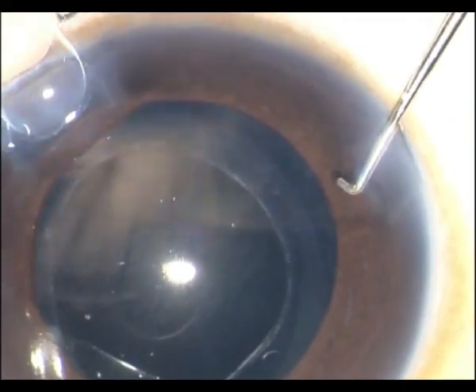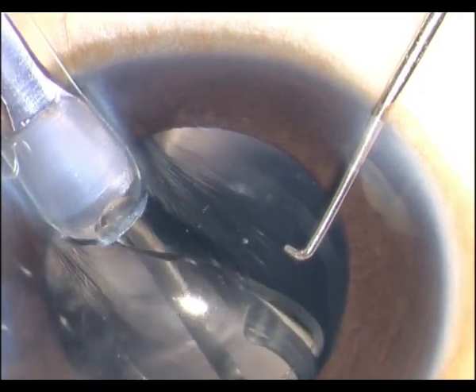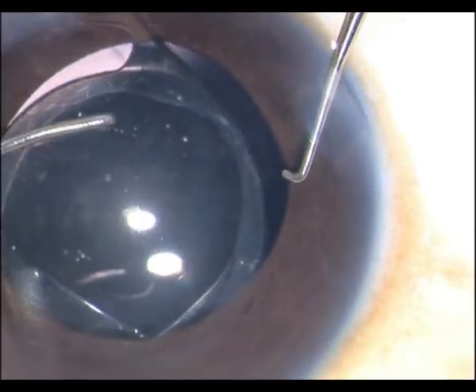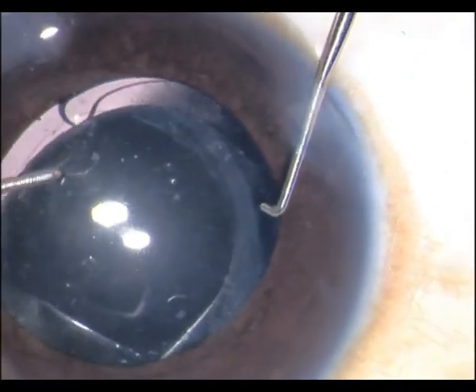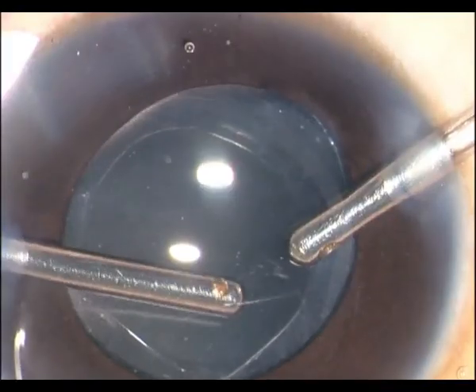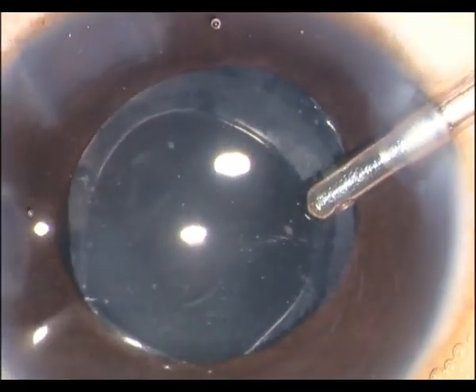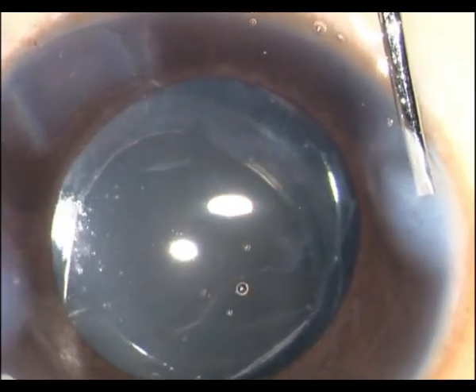Since I am placing the foldable lens which has to go through at 2.8 millimeters, I have increased the incision. I very carefully push first the leading haptic into the bag and then slowly dial and push the trailing haptic into the bag as well. Then with the bimanual I remove — keep pressing — and all the viscoelastic will be aspirated. I then hydrate the wounds, place a drop of atropine, and check my wounds.